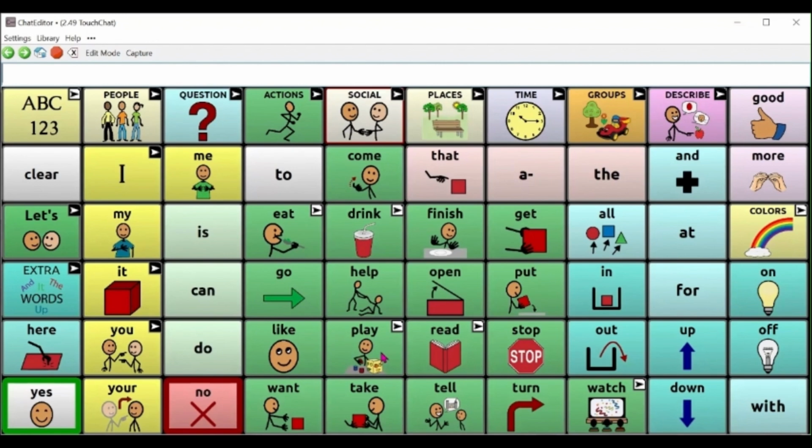And what that means by multimodal communication approach is that a child may use vocalizations, they may use words to communicate, they may use gestures or sign language to communicate, they may use their AAC device to communicate. But we don't say that one way is better than the other. We let them communicate any way they want to. But we know that functionally we can't get through life by just pulling someone to what we want. So we have to add in those words and model that verbally and visually.